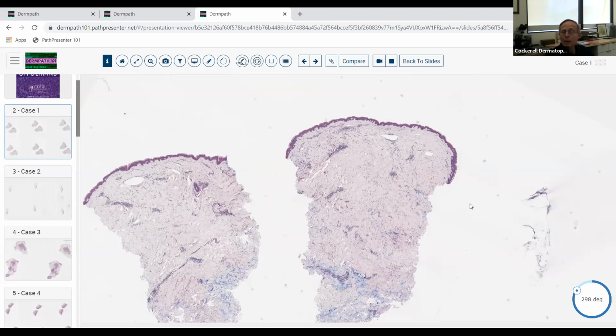And this is probably better for you because on the board, this is the technique that you're going to get. They're going to scan a slide in. They're going to have you use a technique to look at it on a computer or a tablet or something, and then you'll be scrolling it up and back. So this is really more what you're going to see on the board. I think it's analogous to looking under a microscope. It's not exactly the same thing, but it's similar.